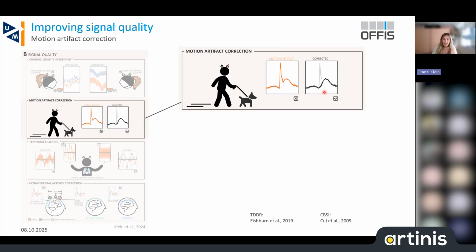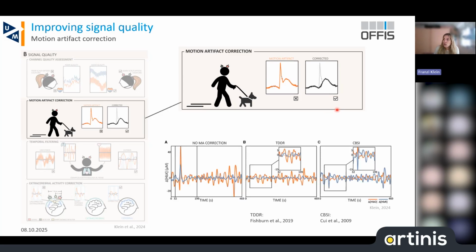So we cannot check the data first and then remove the artifact, because we don't have the information, we don't know the features, and the thresholds for detection could change and so on. So usually we would like to have more automatized artifact correction algorithms where we don't need any parameter tuning. There are also some versions available. There are more than these two, but I'm just mentioning these two because they are quite nice.